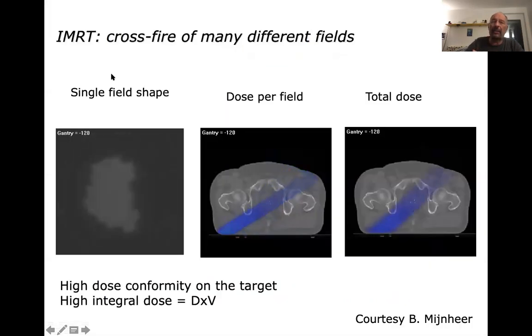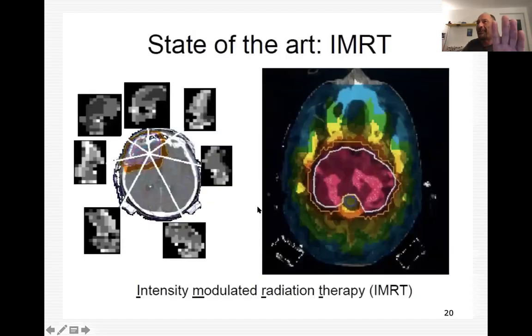This is shown better here. You see the impact of the crossfire. Here, let me see, maybe I will restart. So let me see from here. In the movie that you will see the irradiation from many different angles, this is actually an arc therapy. We will see later what is an arc therapy. So you irradiate under almost every angle.